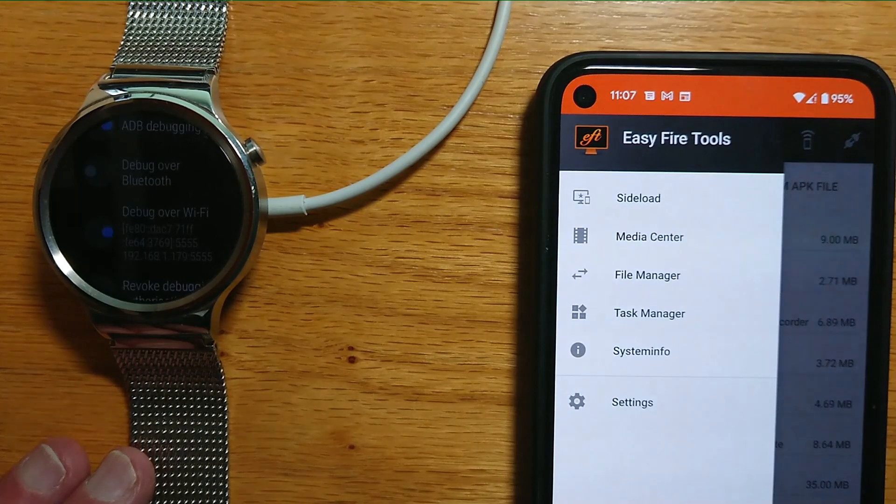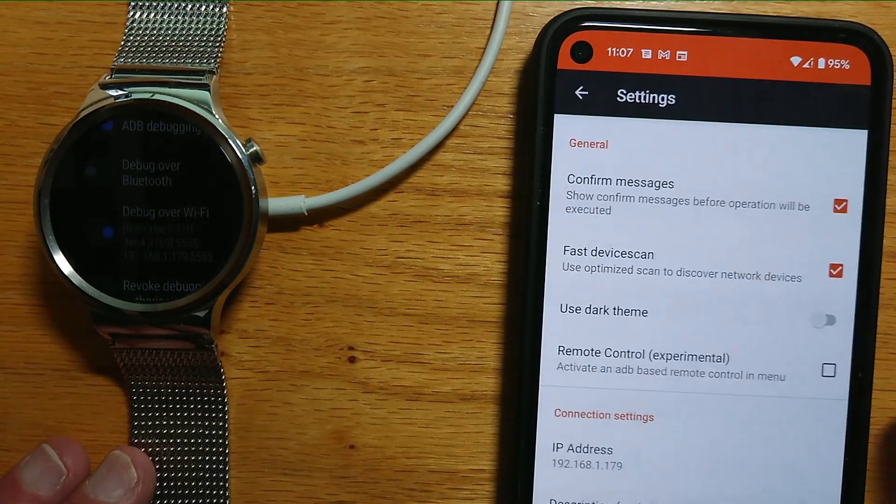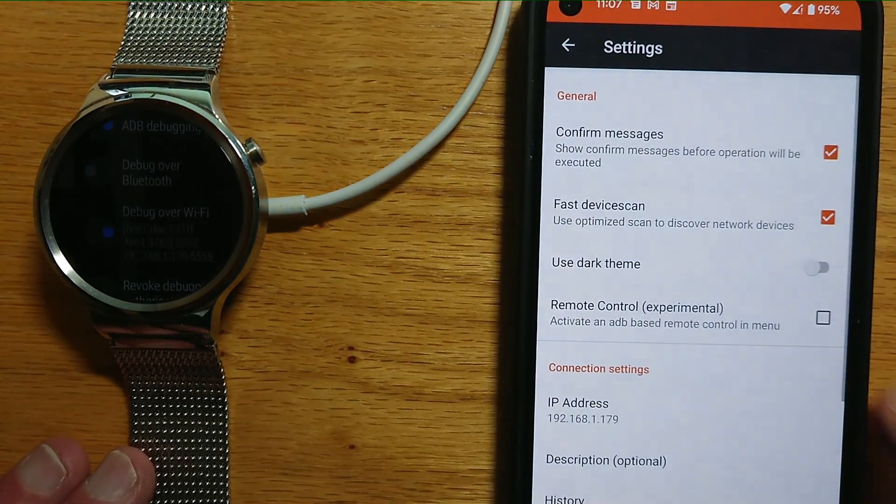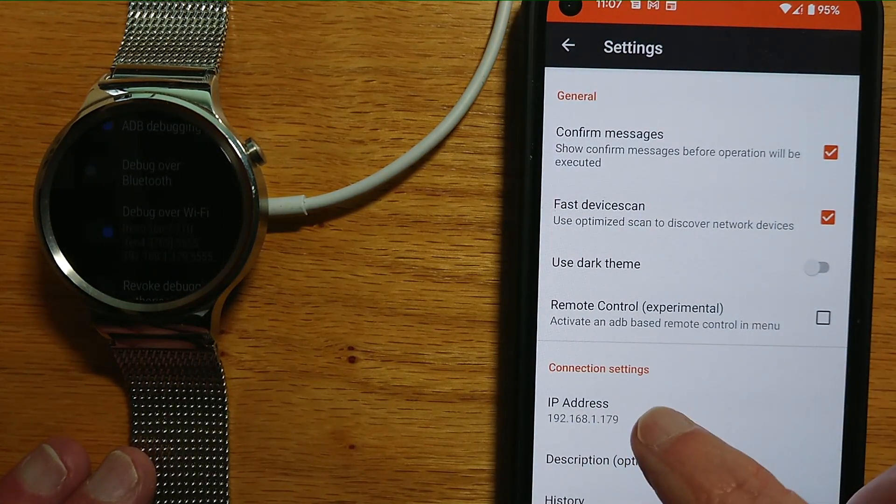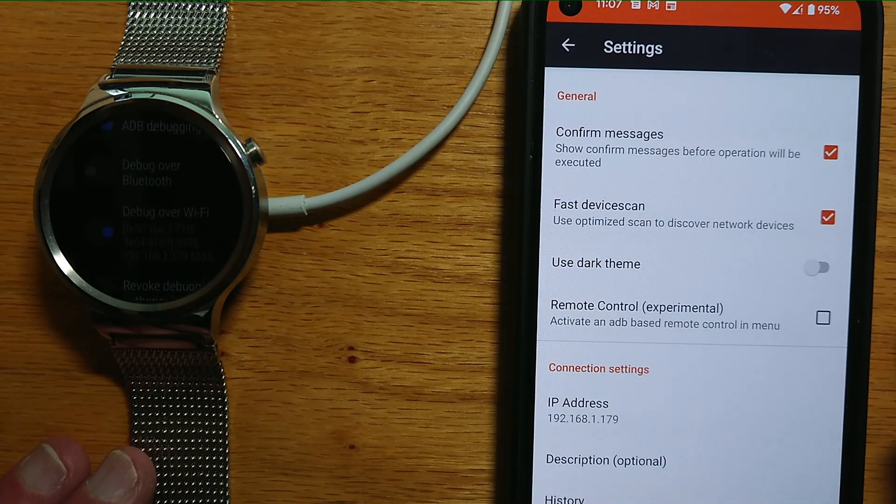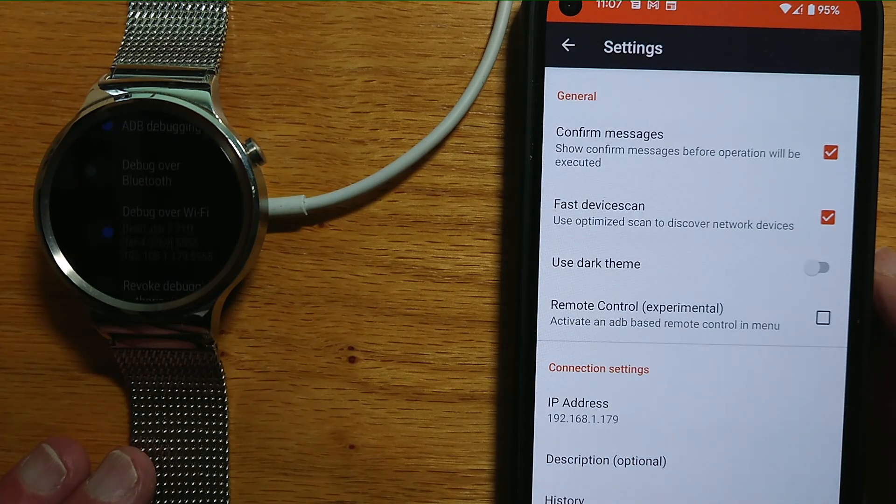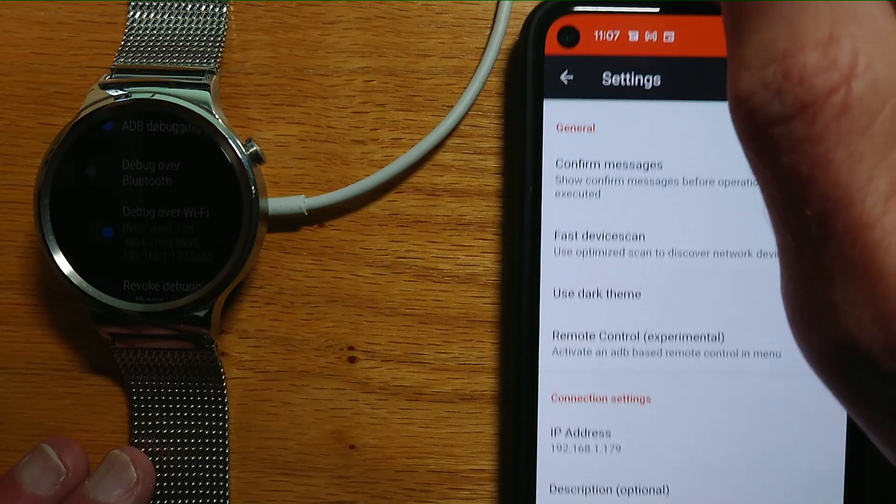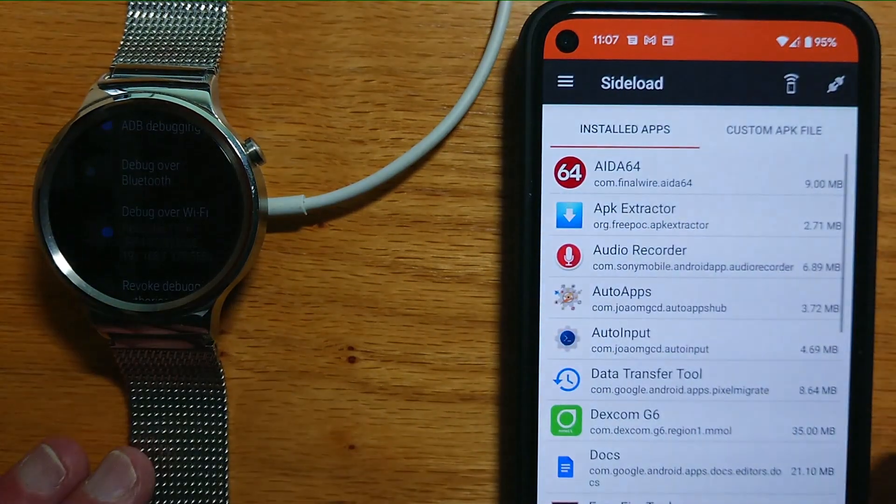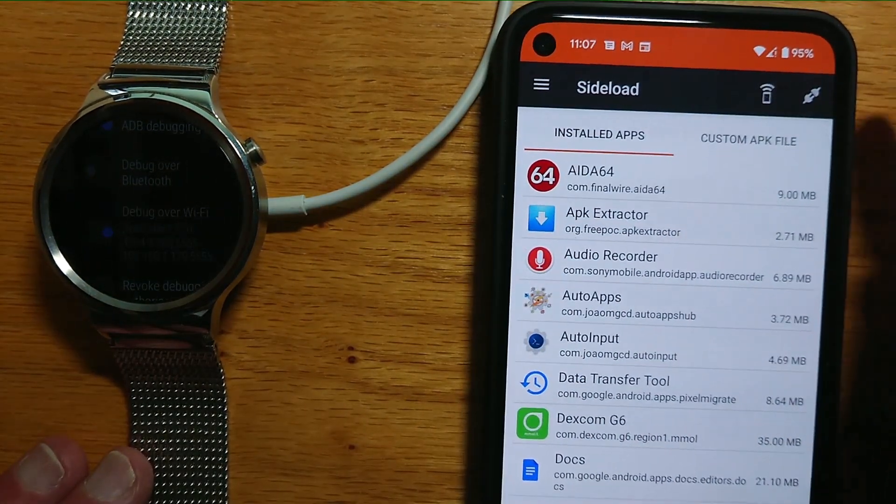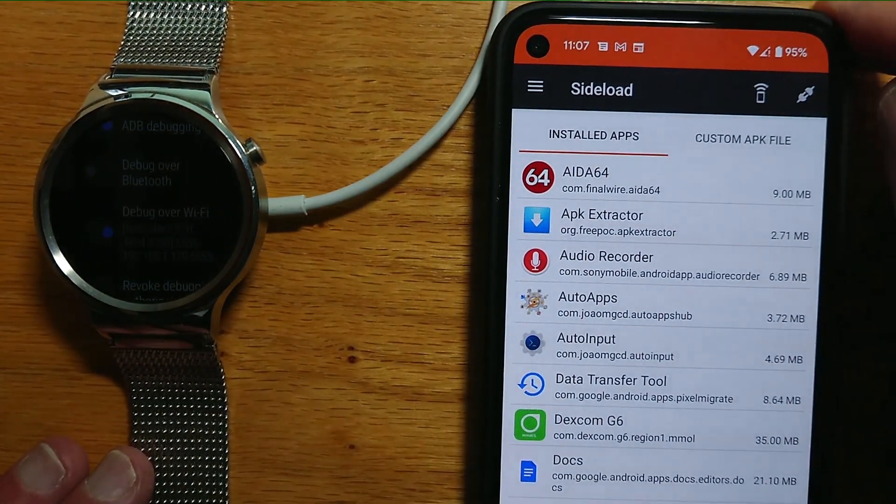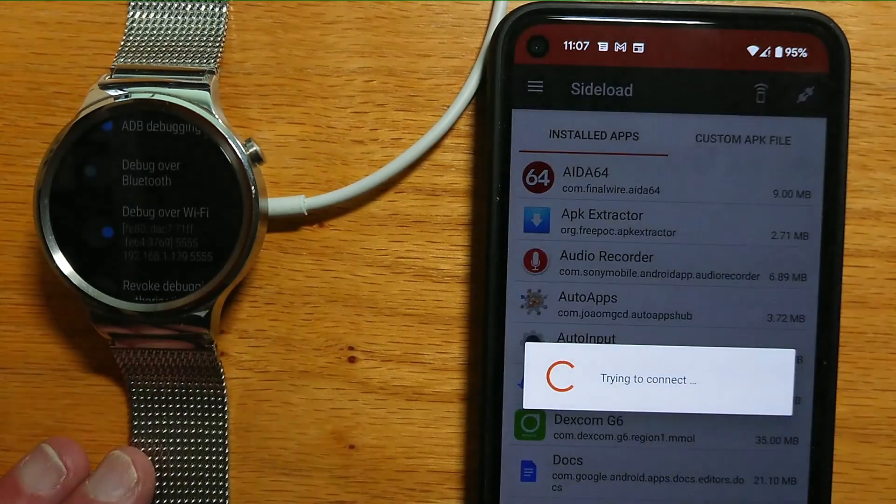Tap the hamburger menu and Settings, and again enter the IP address of your watch here—you can see I've already done it. Let's go back, and there's a little connection icon here. Let's tap it.